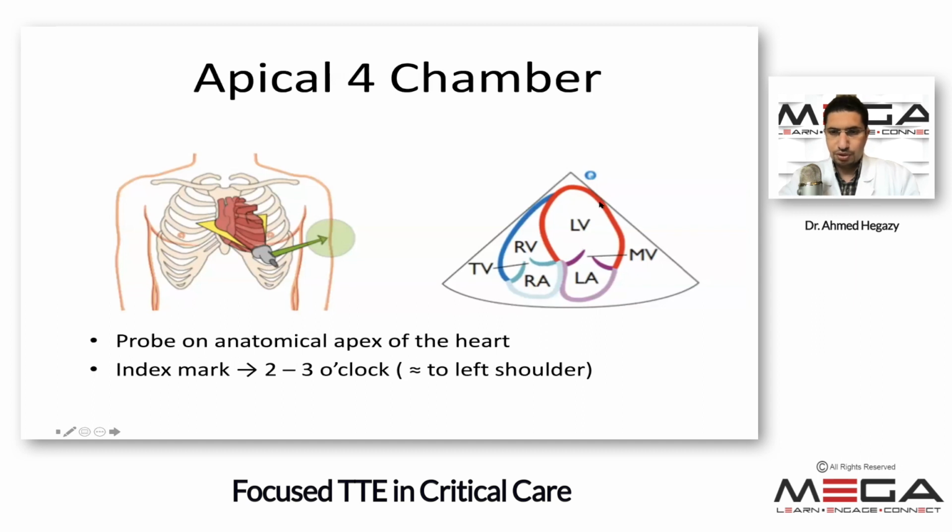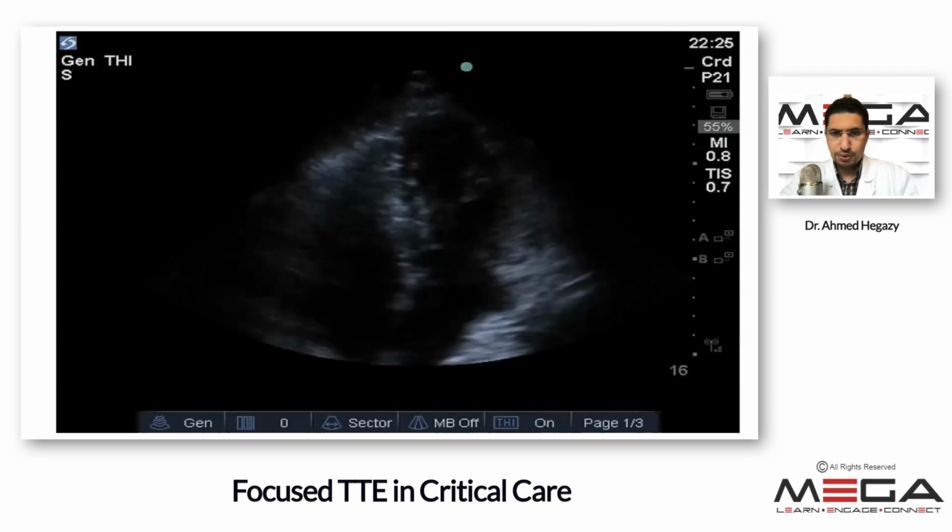So the left ventricle is a bullet-shaped structure. Normally it looks like a bullet shape. The RV, on the other hand, usually looks more triangular. And this is an intuitive view. You see all four chambers of the heart in this view. So this is what it looks like.